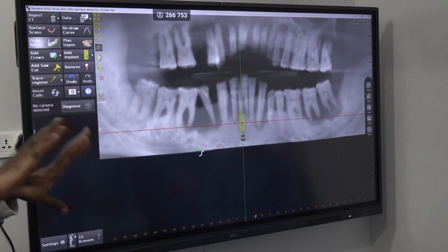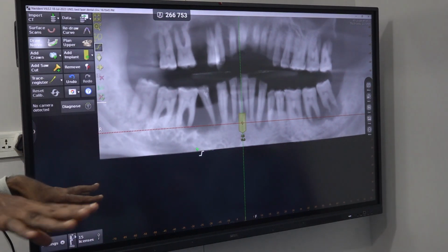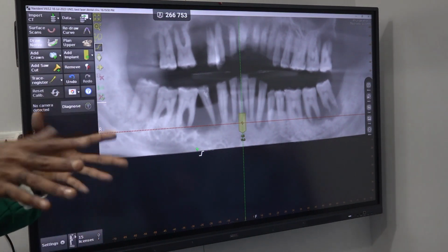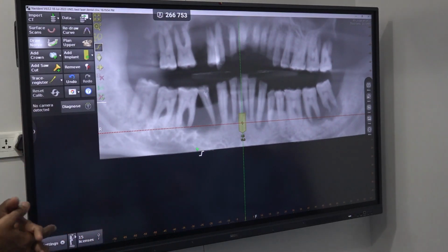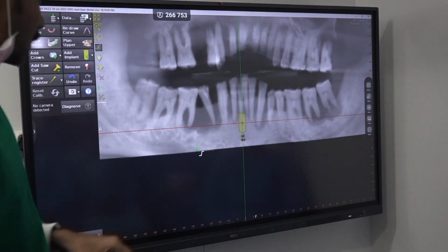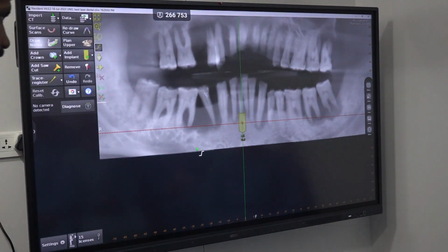In any case, he first extracts all the teeth, waits 2 to 3 weeks until soft tissue healing is done. Then they make the incision, flap reflection and alveoloplasty. What he says is, I don't want to mess with bleeding, I don't want to work with a lot of bleeding, I want to work relaxed. Otherwise, you can remove selective teeth and wait also, because it is too much stress to handle. Implant placement, alveoloplasty and bleeding control together are the main trouble.